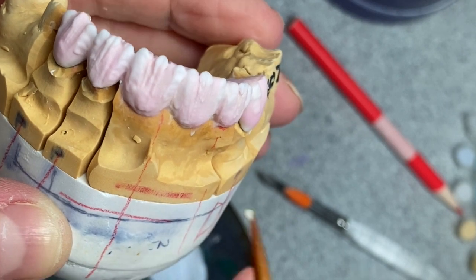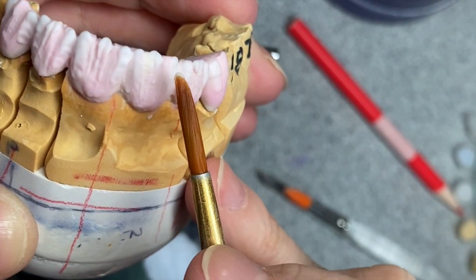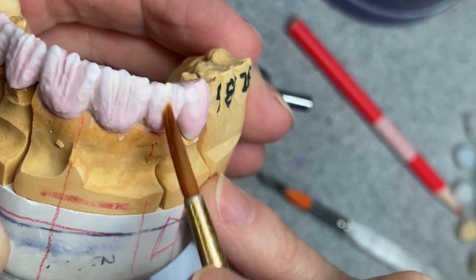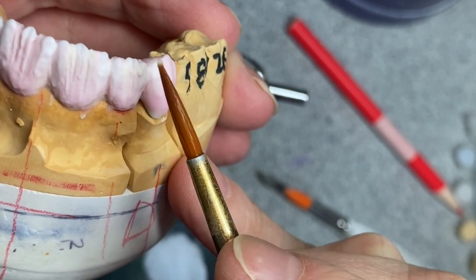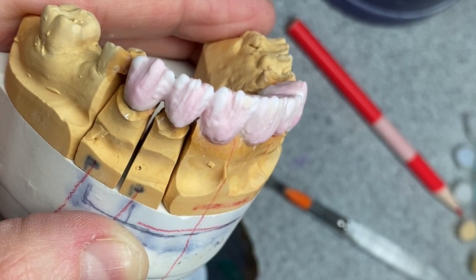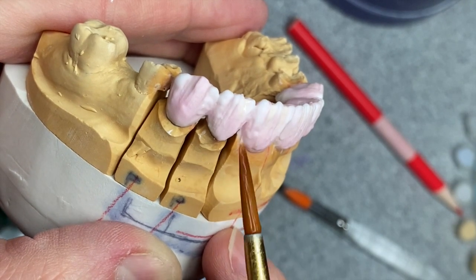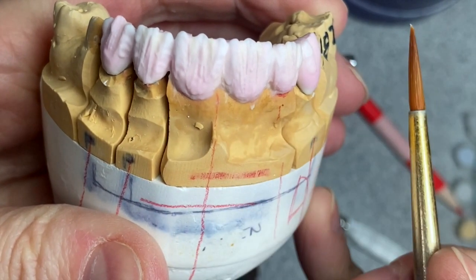I'm going to apply a little bit of my opalescent porcelain in between to make it look like mammelons. I use incisal for that. If you're not very experienced, don't use incisal for that — use something less opaceous — because that can ruin your whole work if you don't apply it correctly. And of course, it's only for cases that have four units and up, and I mean four front units, not just half.